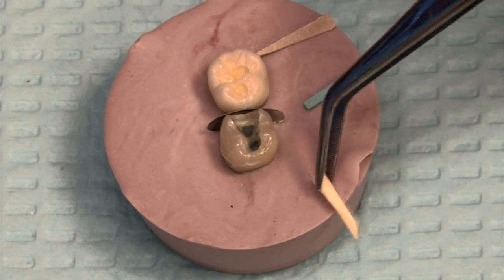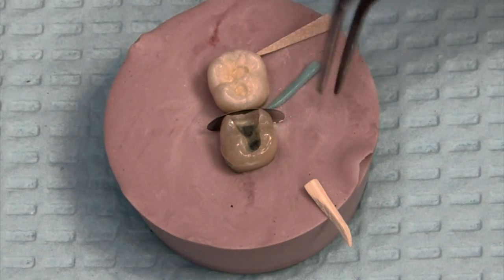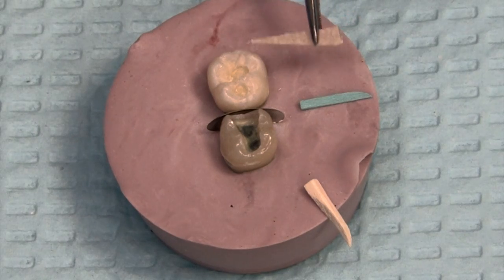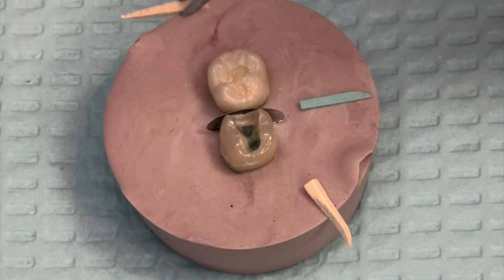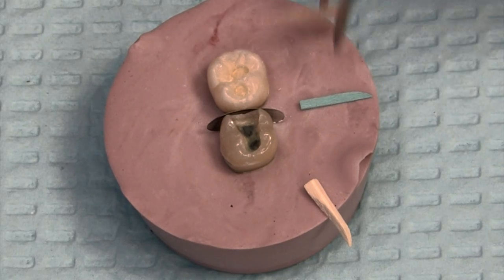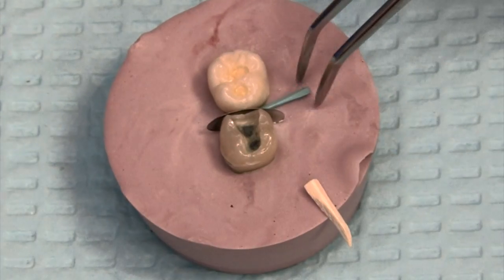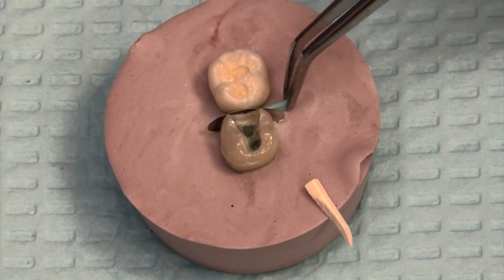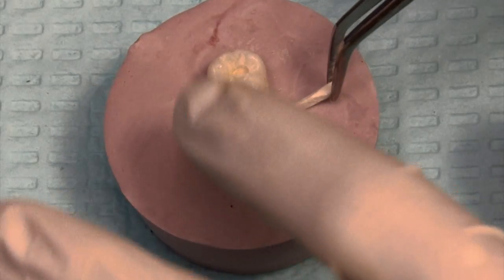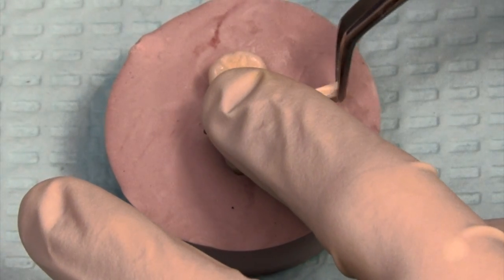This one is more of a rectangular shape — a real thick wooden wedge, probably not the best anatomical shape, but for teeth that are wide apart it will work out fine. The main goal is to get a good gingival seal while you're getting your filling placed. The light blue wedge just slides in too easily, there's no wedging effect, so I'm going to use this thicker wedge. Slide that right in there to create a good embrasure, and push it into position — just get it nice and snug. You don't have to shove it really hard, just enough to get that sectional matrix stabilized.